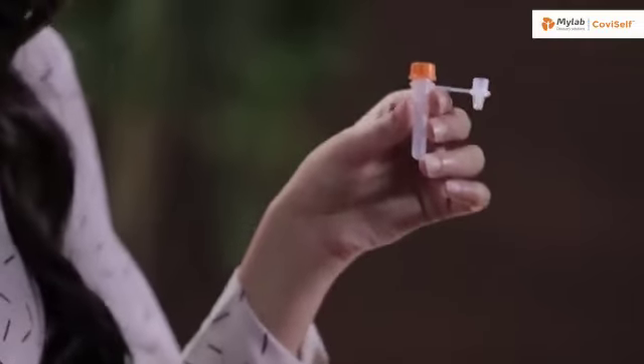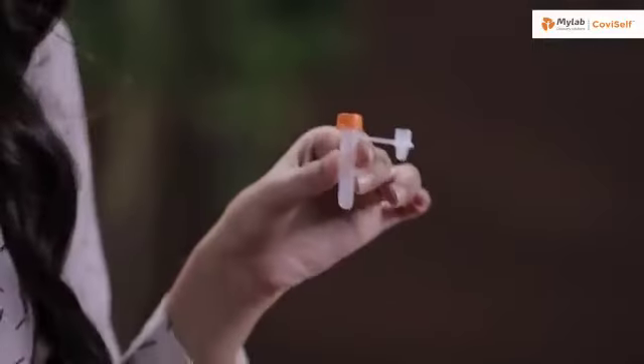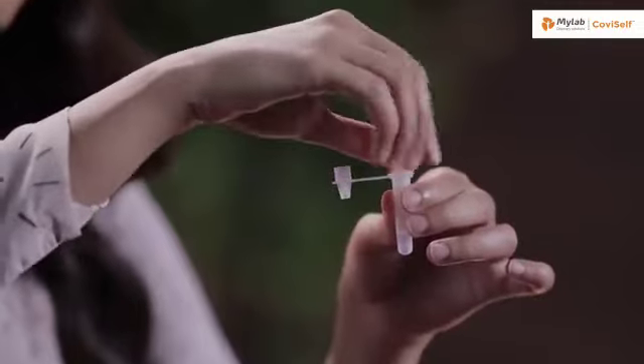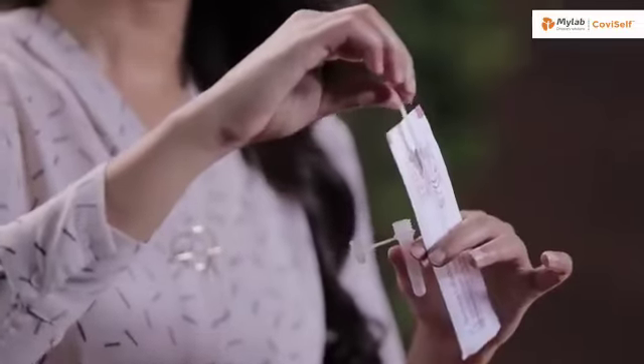Take the pre-filled extraction tube and tap it gently three or four times to ensure that the liquid settles at the bottom. Unscrew the cap and hold the tube in your hand. Open the sterile nasal swab while holding the tube in your hand. Tear it from the tail end. It's important that you do not touch the swab head.